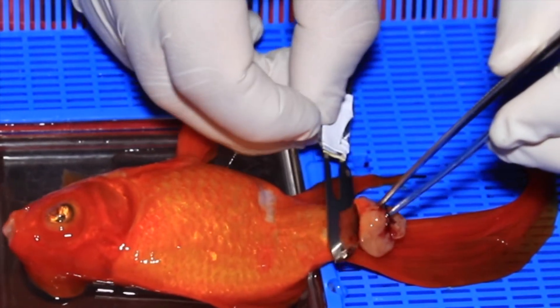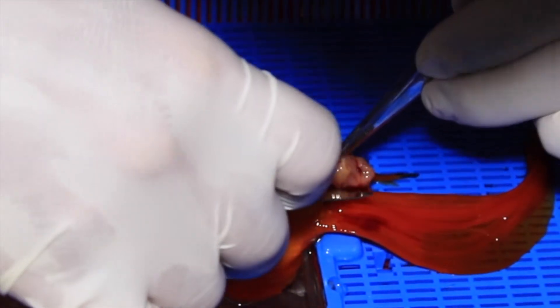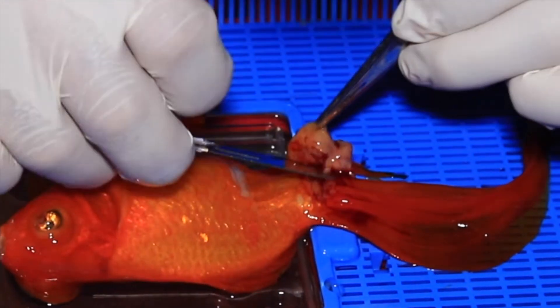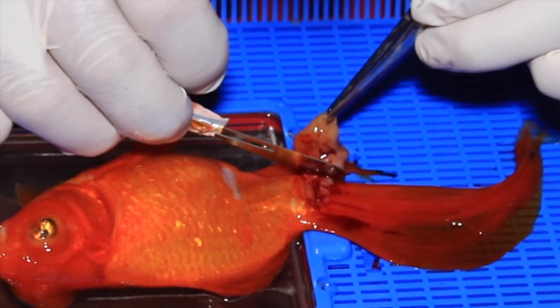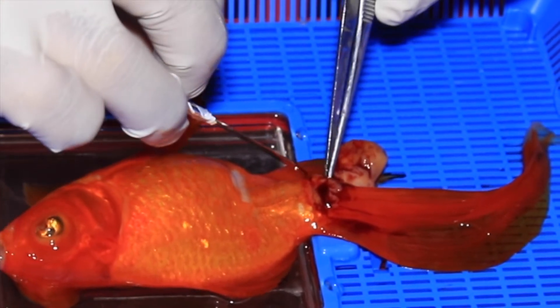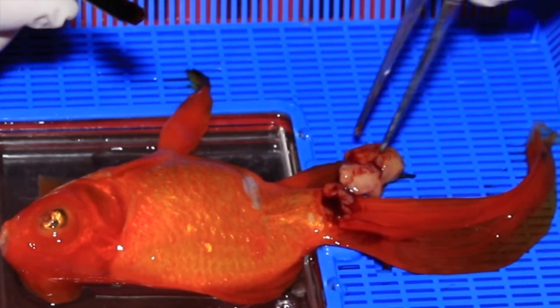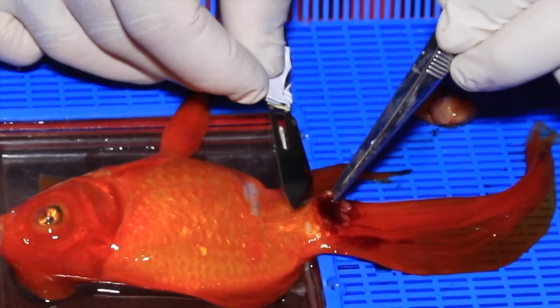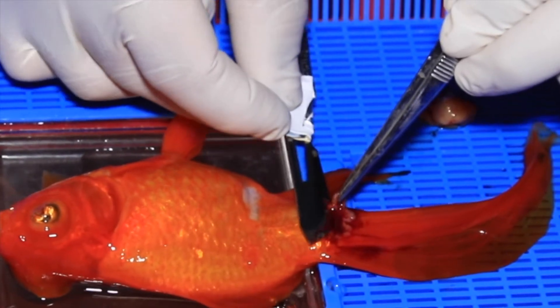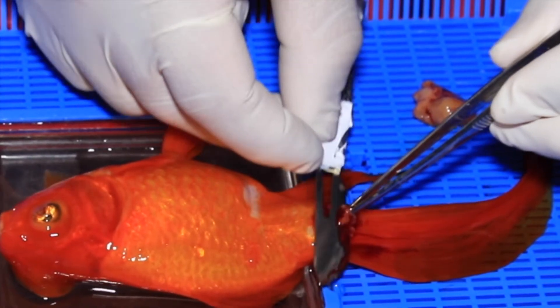I can see it bleeds quite a lot, so I have to be careful, cut off as quickly as I can, and then start applying hemostasis to prevent her from bleeding out. You can see blood welling up at the site where we've removed the tumour.